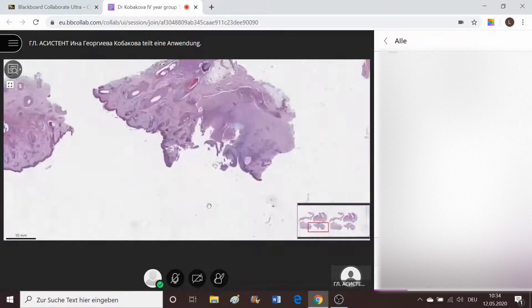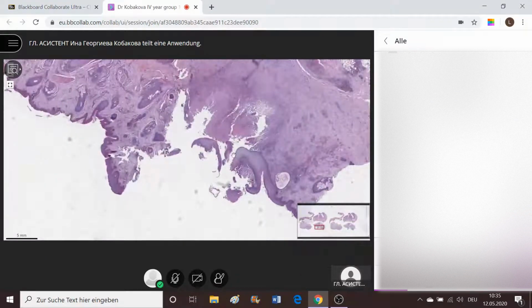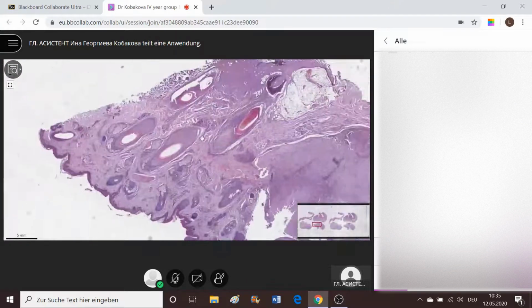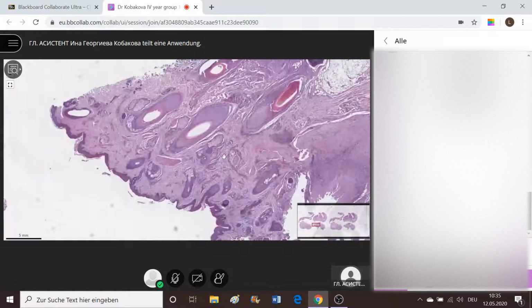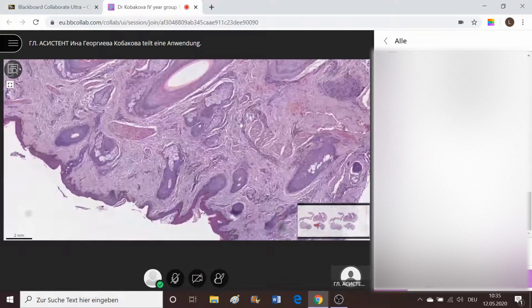What I see here is something else. It's artificially desquamated part of the skin. It's not because it's forming ulceration. And what you also should mention about skin are the different adnexal appendages which you're able to observe, like hair follicles, like fatty glands, sweaty glands.